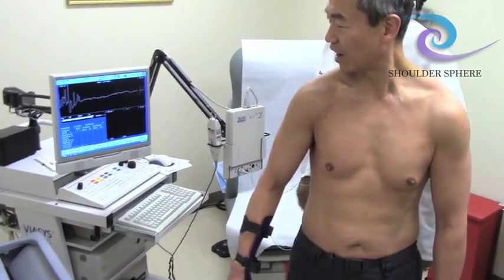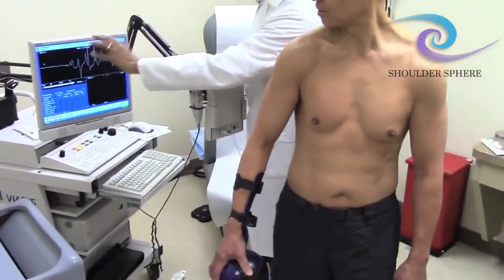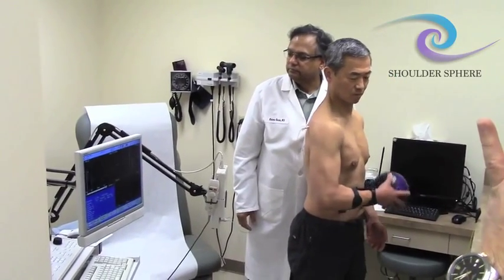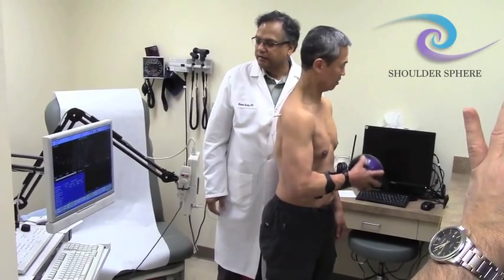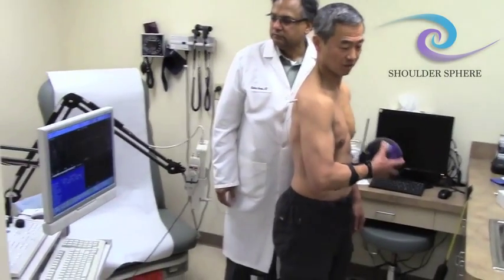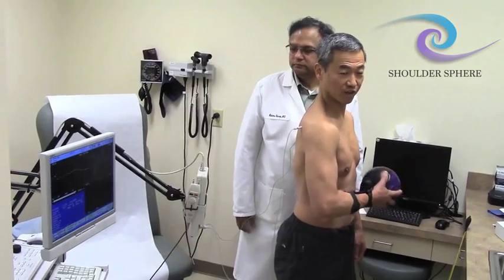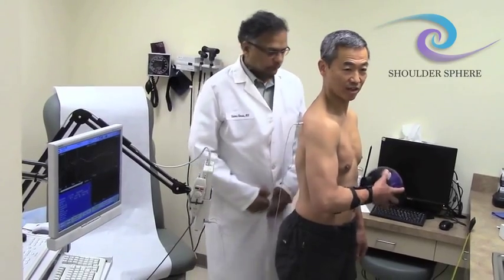By decreasing the velocity of the RPM, I decrease the firing rate. These muscles are firing, stopping, firing, stopping — it's not continuous. You get an on-off, on-off pattern. In position number two, it also hits the infraspinatus. In order to keep it spinning, all the energy is derived from the rotator cuff because the elbow function only goes up and down. As you notice, the wrist is locked in position, so I cannot cheat by movement of the wrist.